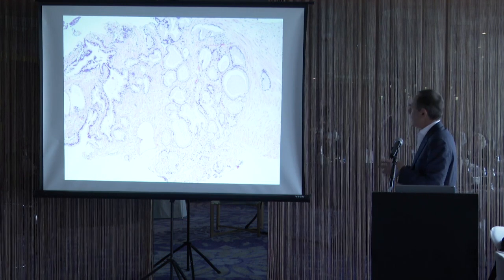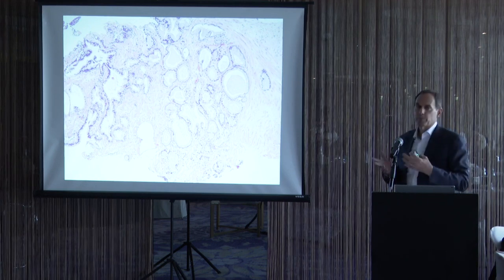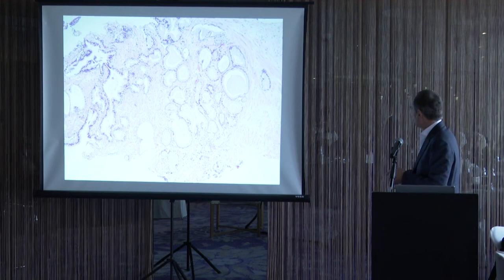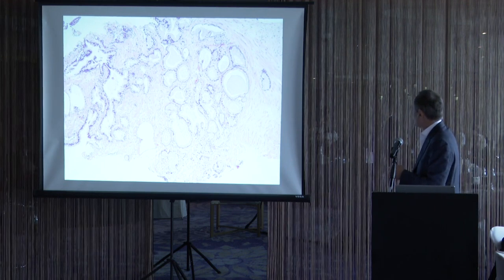On the right, we're getting mixed signals. The glands are fairly large, just as large as some of the benign glands, much larger than the typical glands of prostate cancer that I showed in previous slides. Some of the glands have infolding, but this focus is more crowded. Also, as we'll show at higher power, some of these glands have a sharp, straight luminal border, despite the glands being fairly large with a lot of cytoplasm.